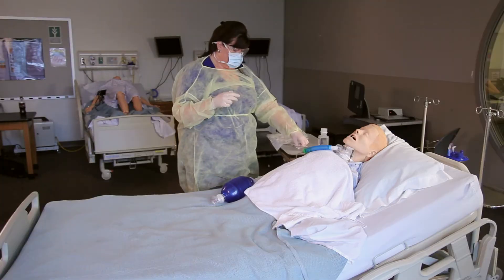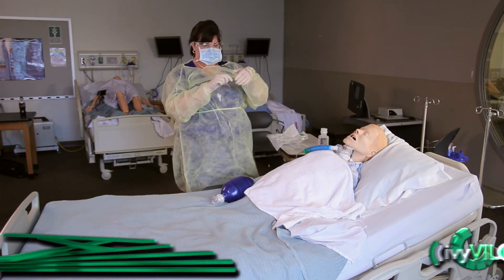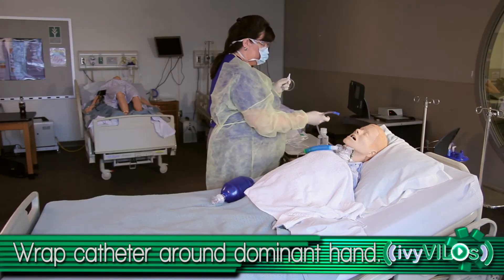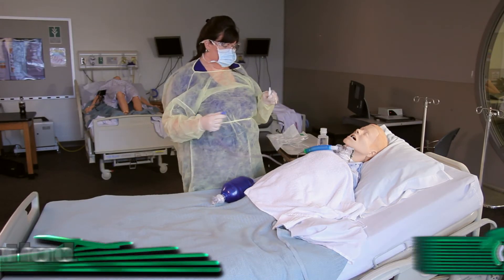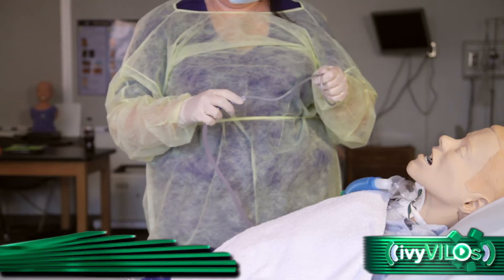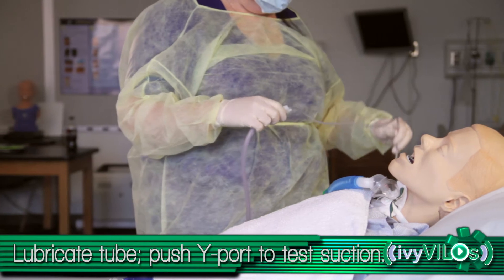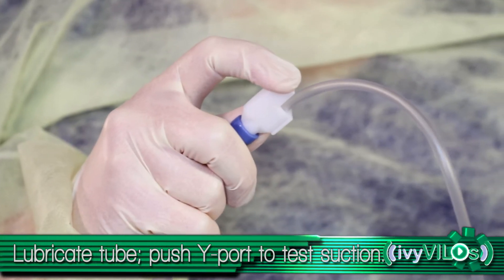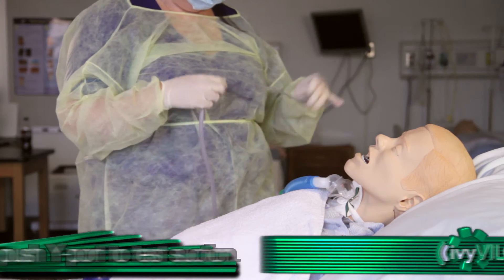Pick up the sterile catheter with your dominant hand. Connect the tubing to the suction catheter. Moisten the tip of the catheter in the container's saline. Occlude the Y port or open hole on the suction catheter to check the suction.